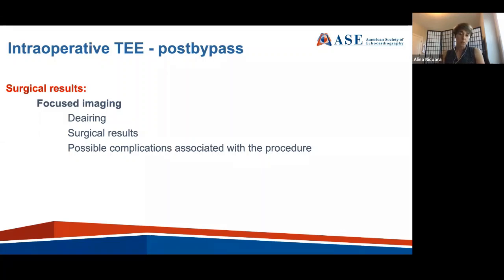We may be caring for the patient at the same time we are performing this TEE examination in quite less than ideal conditions sometimes. There is prosthetic material, there may be sutures, air, lap pads, chest tubes, which could degrade the quality of imaging. At the same time, the surgeon is still performing a surgical procedure, and they are receiving a great deal of information which has to be reconciled with the hemodynamic data, patient factors, and expected challenges, be it immediate technical if we do have to go back on pump, or down the road in patient recovery. So it can be quite a stressful time. However, there is no better time to be a team than right then.